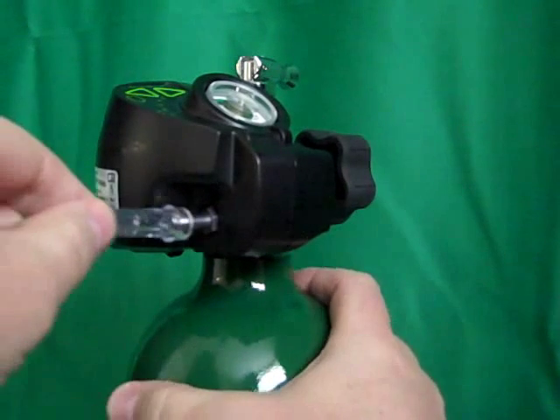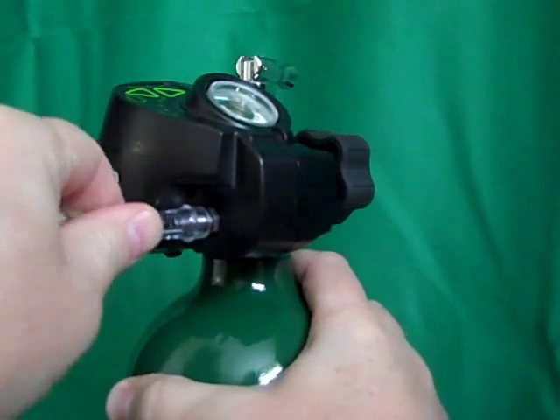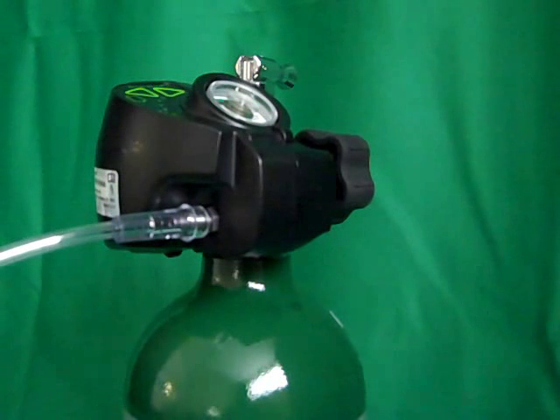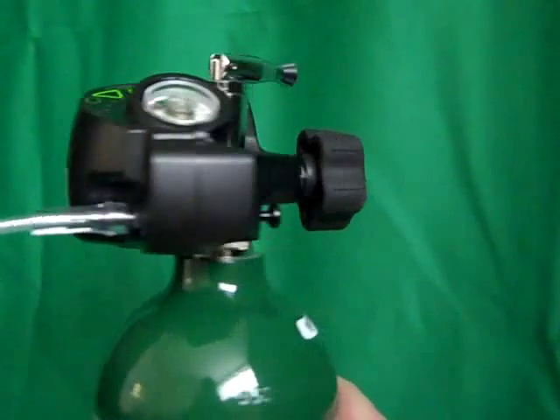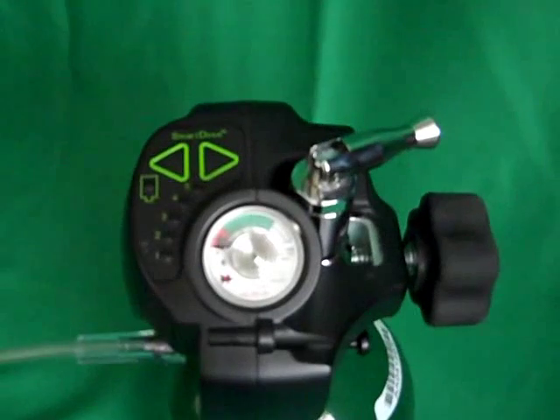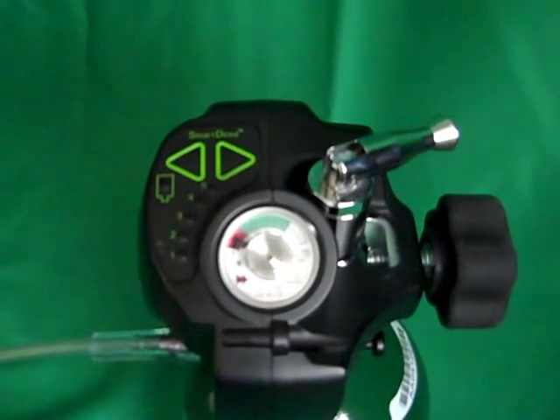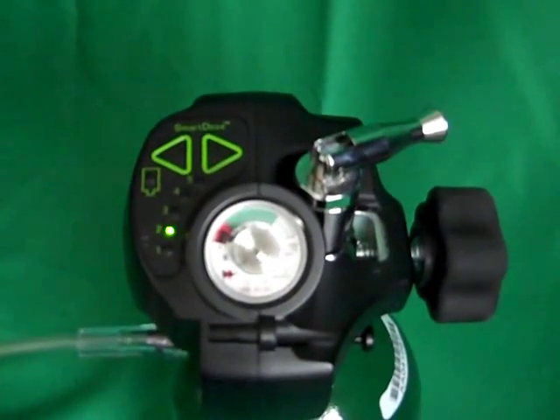Looking at the side of the unit, you will see a barbed fitting. To attach your oxygen cannula, simply push the tubing onto the barbed fitting to secure it. You will see that each time you inhale, a light will flash. This indicates that SmartDose recognized the inhale and delivered a dose of oxygen. The light that flashes will correlate to the current unit setting. In this case, my unit is set to two, and each time I breathe, the two light flashes.